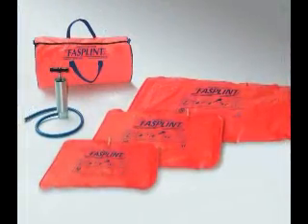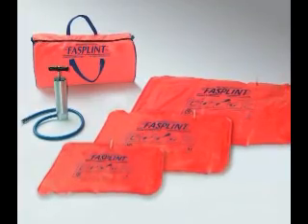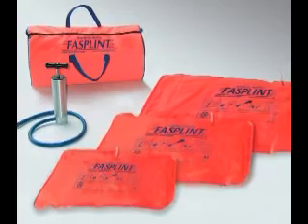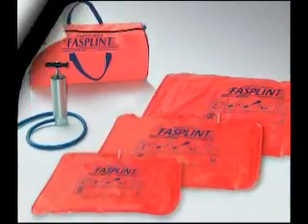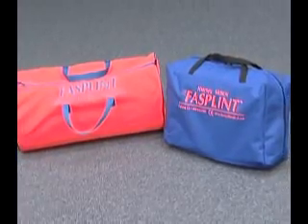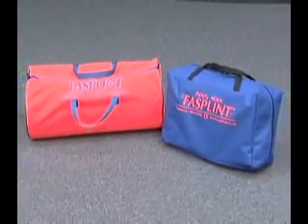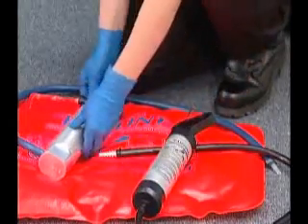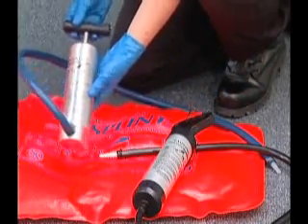The basic Fast Splint kit consists of three splint sizes — small, medium, and large — a compact manual pump, and a carry case. Kits may be configured with the standard duffel-style case or a rectangular-shaped carry case. An optional plastic pump is also available as a substitute for the supplied aluminum compact pump.